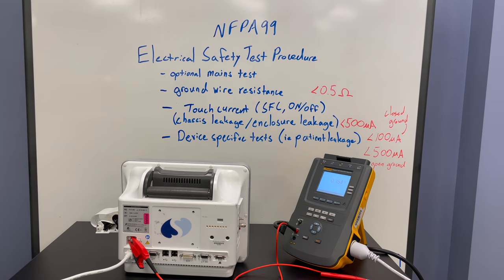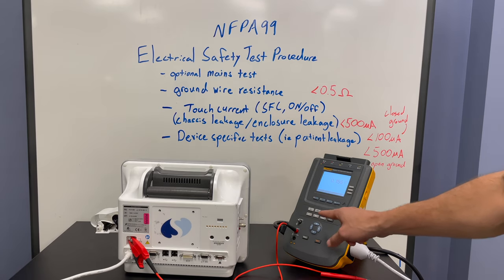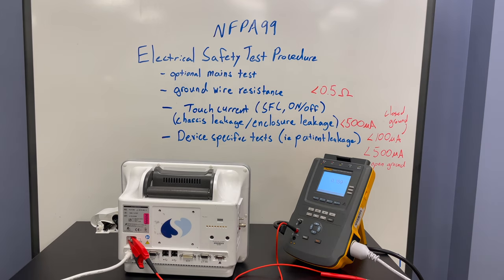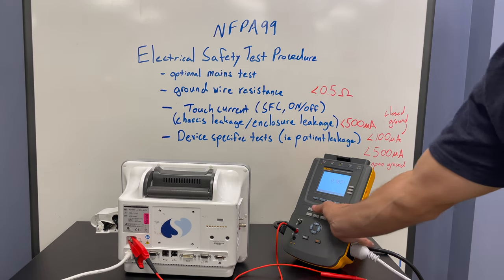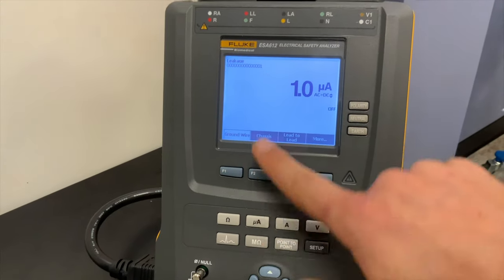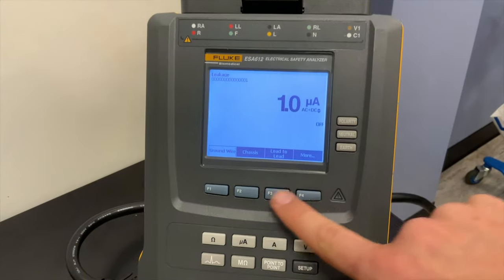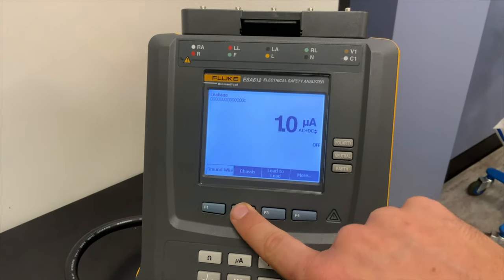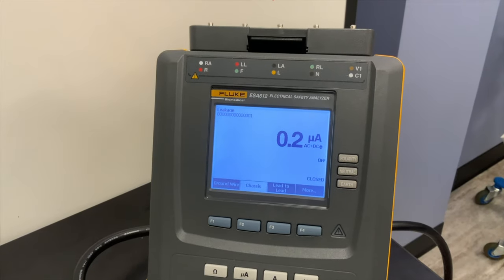Our next test is going to be touch current in a single fault condition with the device both on and off. We hit the microamps button on our tester. Once we do, you can see it switches over to leakage current — right now it's measuring ground wire leakage. What we're interested in is touch current, also known as chassis leakage or enclosure leakage.